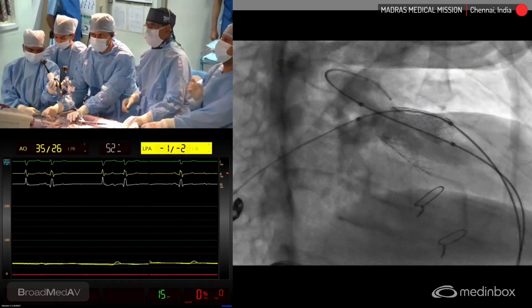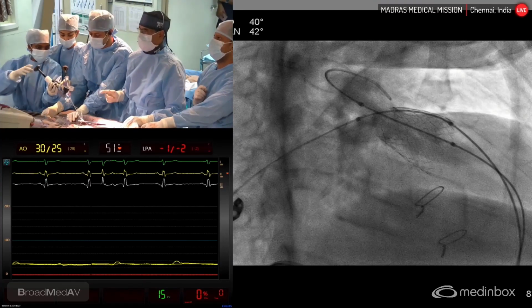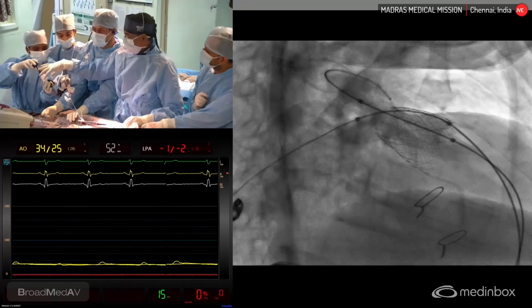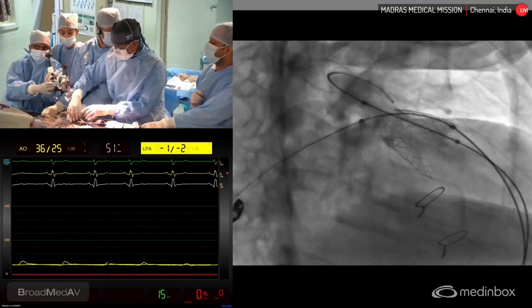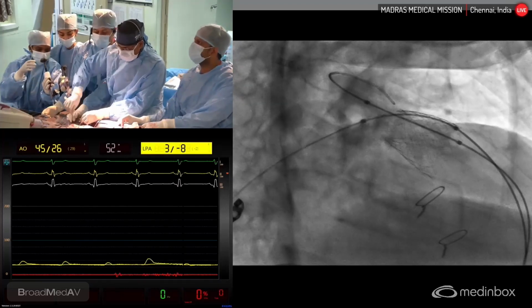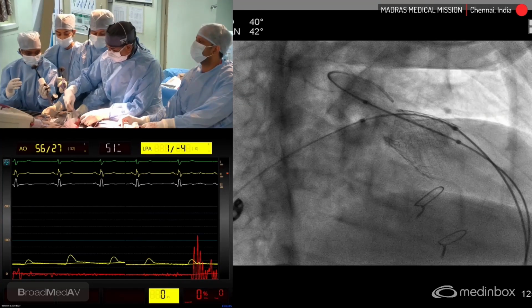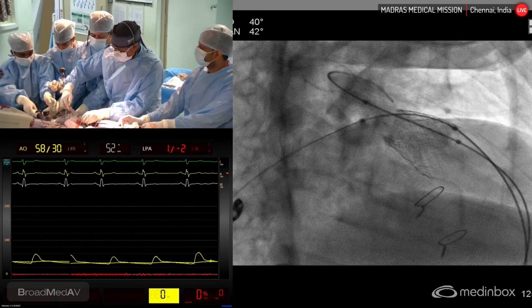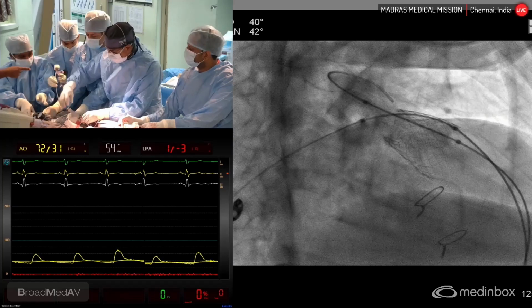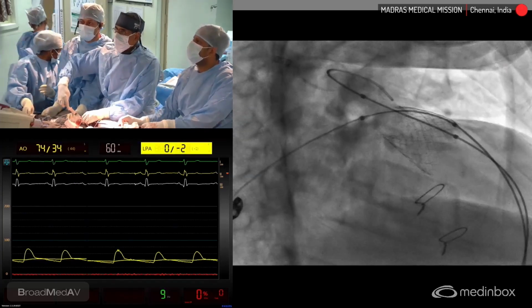Show the stent now. The aortic pressure is low because we had occluded the outflow tract. Both the balloons should be deflated fully. The pressures are slowly picking up. I will now deflate, empty the balloon, empty the indiflator and empty this one.